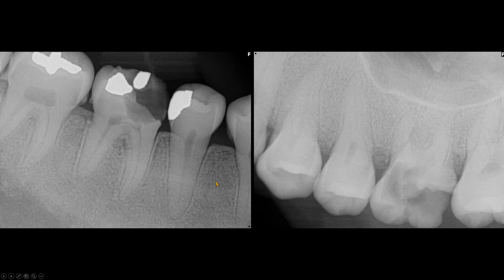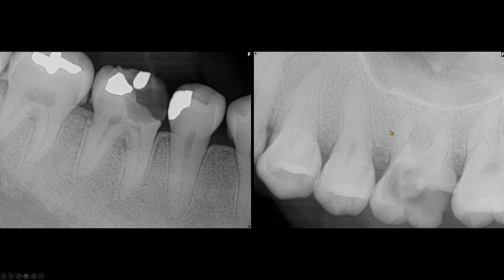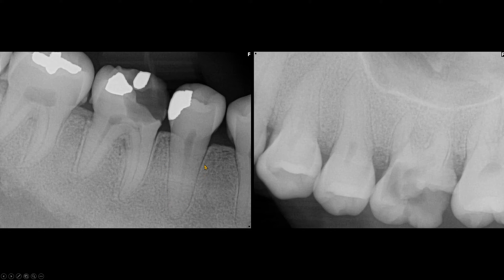Also, you can see that the lamina dura of several teeth are thin or missing. Same here on the mandibular arch — we do not see the lamina dura. Here, it is very faint.